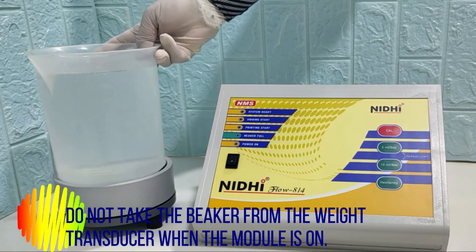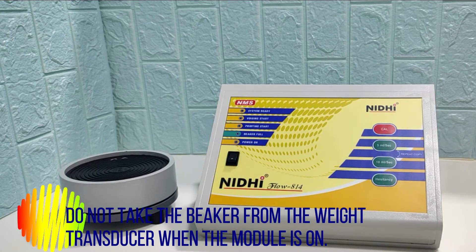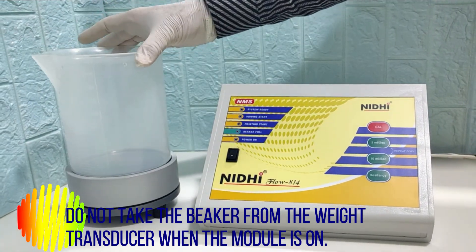Take the beaker from the weight transducer and keep the empty beaker on the weight transducer.